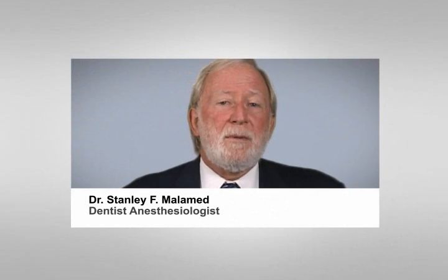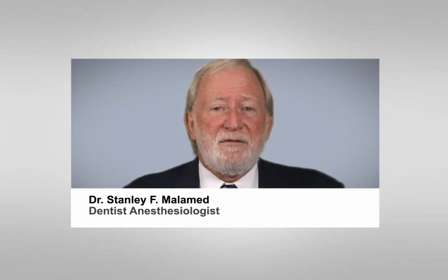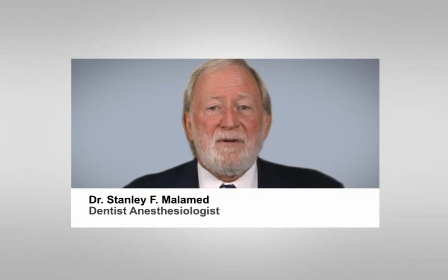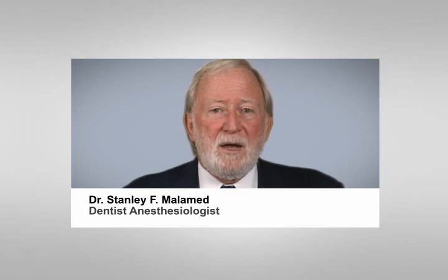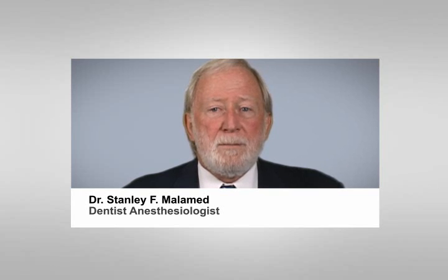The STA system allows you to use the birotational insertion technique to prevent needle deflection, minimizing missed blocks, making your blocks more accurate and providing a shorter onset of anesthesia. Additionally, the STA is the only injection system available that allows one to employ a unique multi-cartridge injection. Let's discuss how to begin.